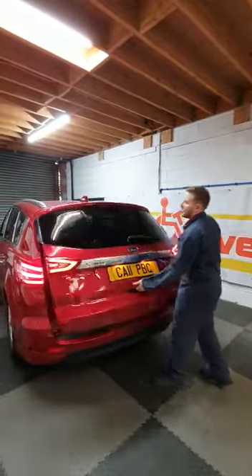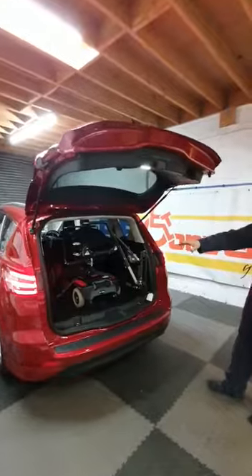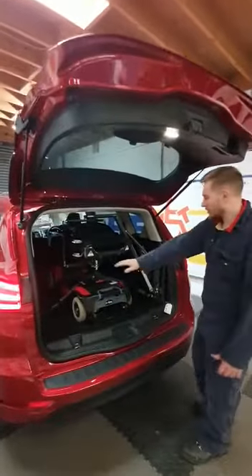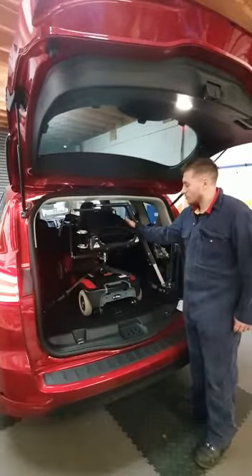Here we have your AutoChair 80kg LC hoist. As you can see, this is how we need to have it in transit. We've got the seatbelt on here, and we also had to take off one of the armrests to allow the room up here.